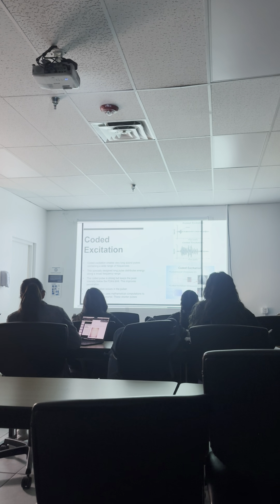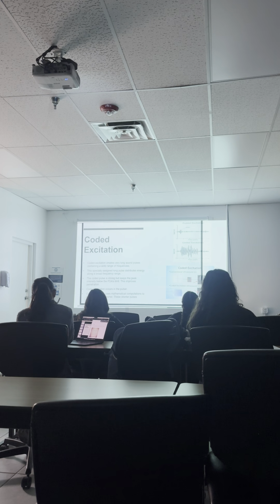Okay, so coded excitation creates very long sound pulses containing a wide range of frequencies. This long pulse distributes energy along a broad frequency range. The encoded pulse is strong, but it keeps the peak intensity below the FDA's limit.